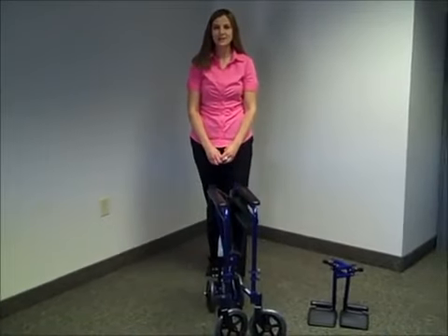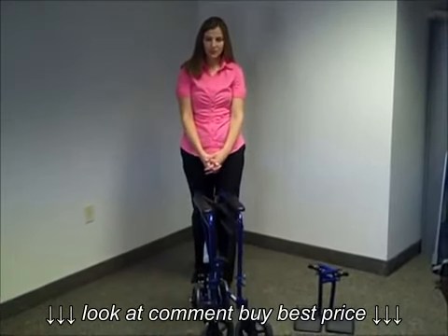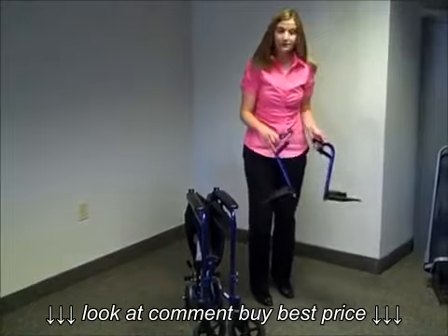Hi, I'm Shannon with Actively Now and today we're going to talk about what you can expect when you receive your transport wheelchair. Your wheelchair will arrive in three parts. You'll have the chair itself and then a right and a left footrest.